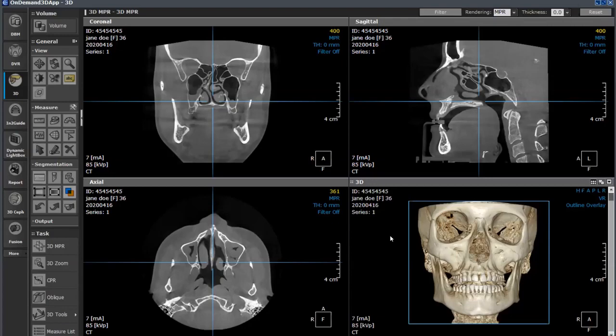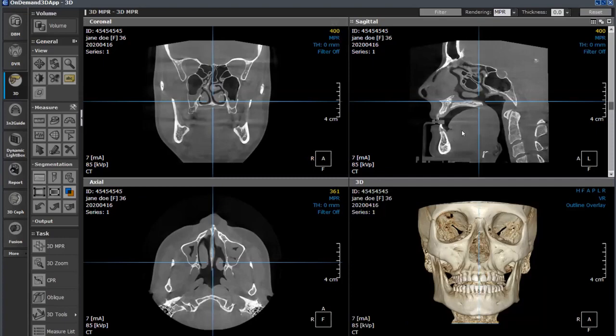A lot of what is out there is interesting marketing, with people saying that they can do a certain number. But when you actually look at the images they create, because they're looking for smaller and smaller voxels, they may not get the image quality that you're getting with this size voxel, primarily because you get such a signal to noise ratio that any algorithm is going to have a hard time interpreting that. So we chose to keep ours at 0.1 so that we are able to give you the most information and the clearest information we possibly can without that distortion.